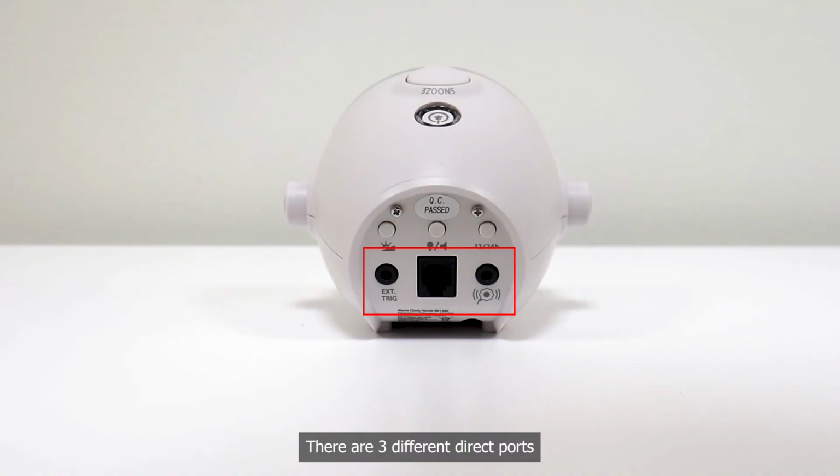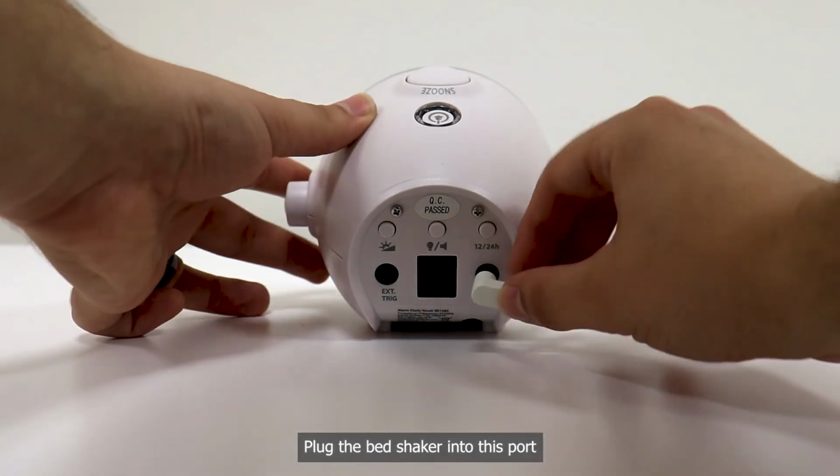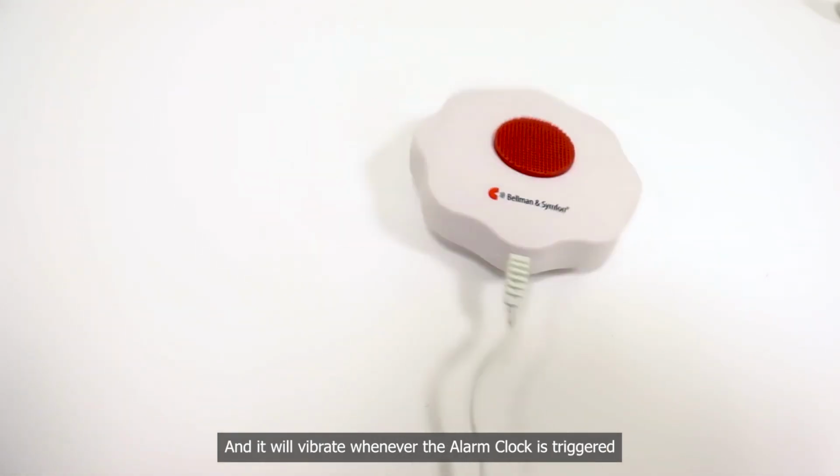There are 3 different direct ports that you can see on the back of the alarm clock here. This is the bed shaker connection as mentioned earlier. Plug the bed shaker into this port. Then place it under your pillow or mattress, and it will vibrate whenever the alarm clock is triggered.